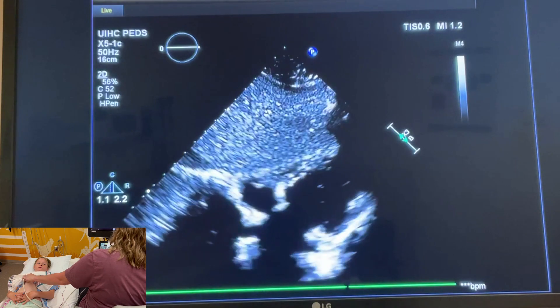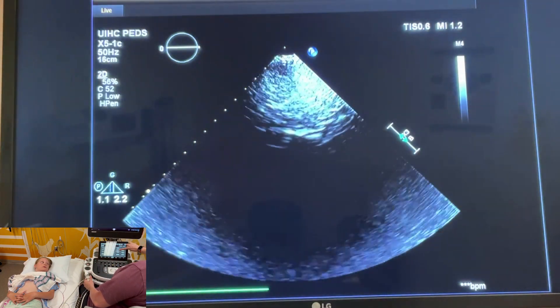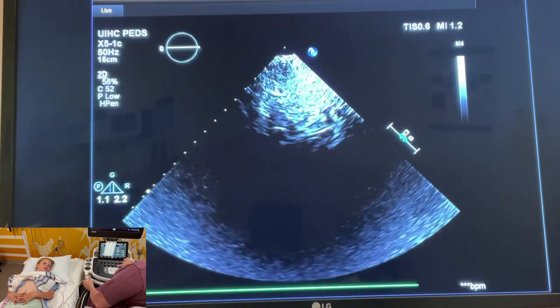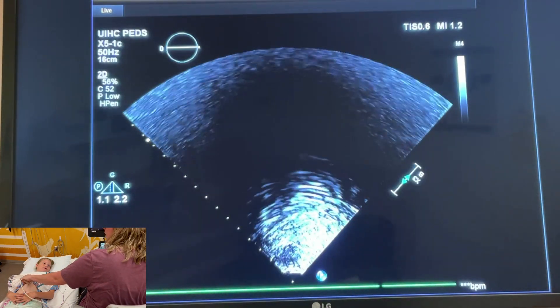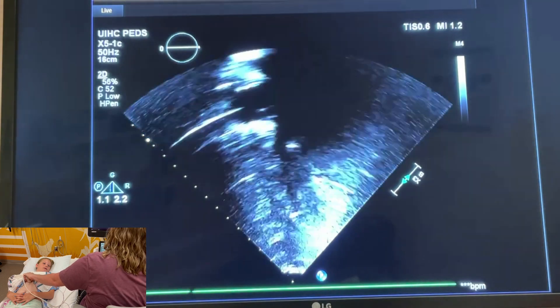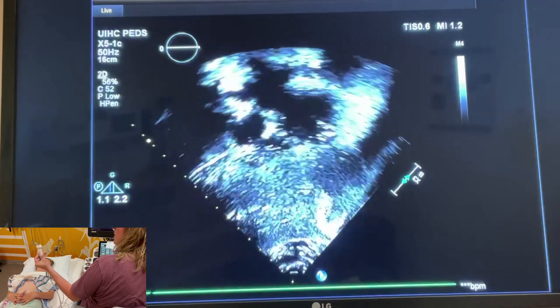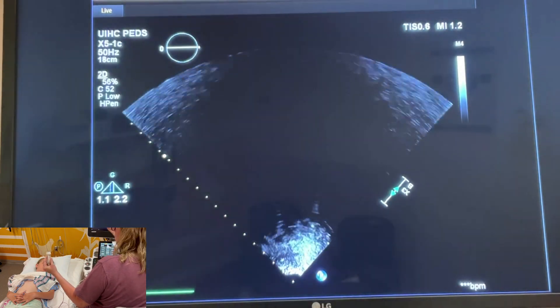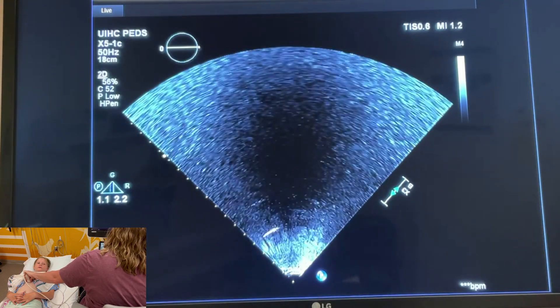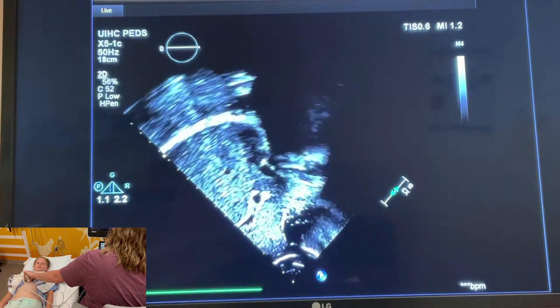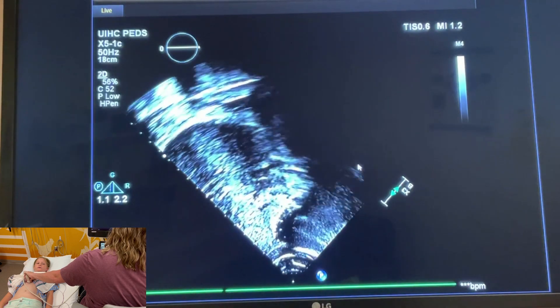Now we're going to flip the image. You have this button here that says up/down — push that button. Now your image is flipped and we're going to do this so that you have an anatomically correct view of the heart. We're still in the notch facing knee position doing a transverse view. Now you can see the IVC here in the liver, and we're going to do a slow sweep up and you'll see a four chamber view come into focus.